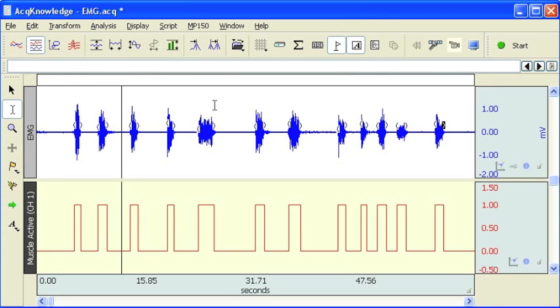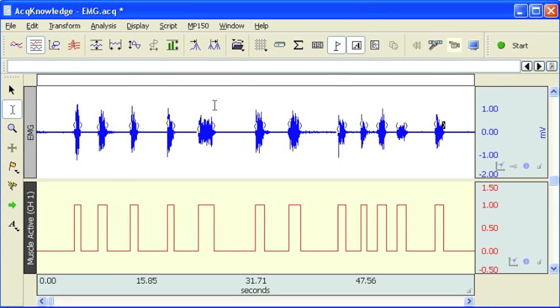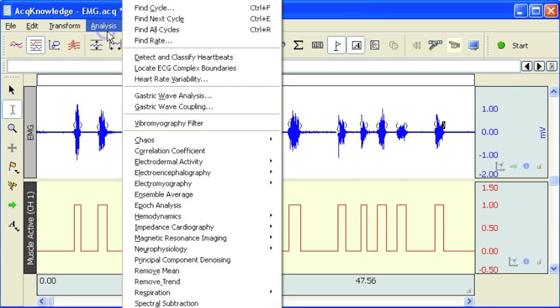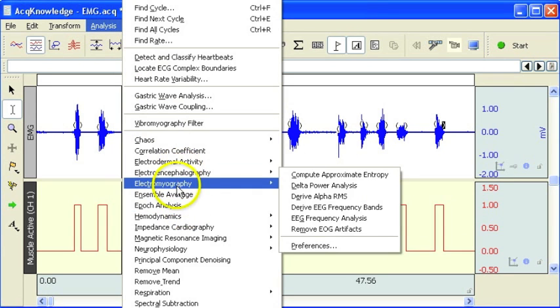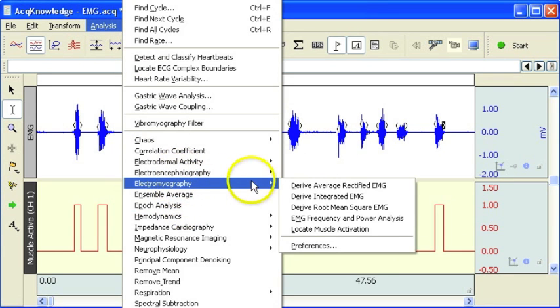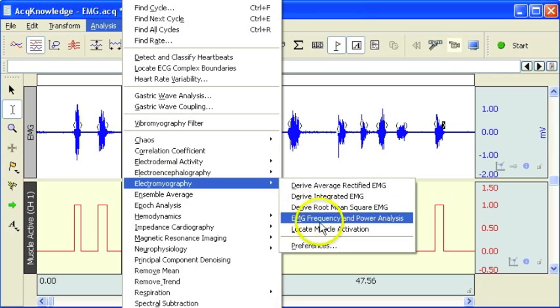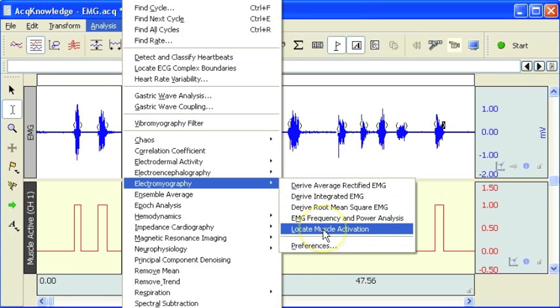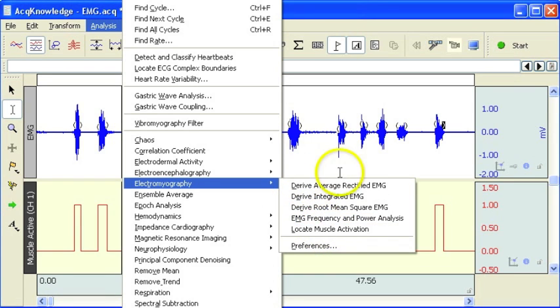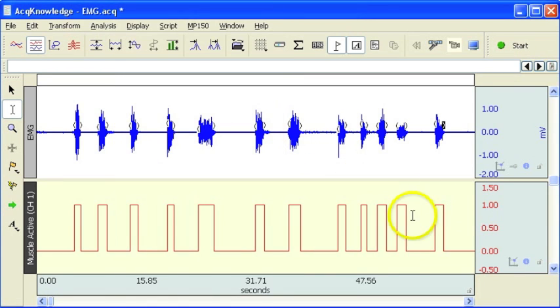So that concludes this introduction to the EMG, electromyography, locate muscle activation demonstration.